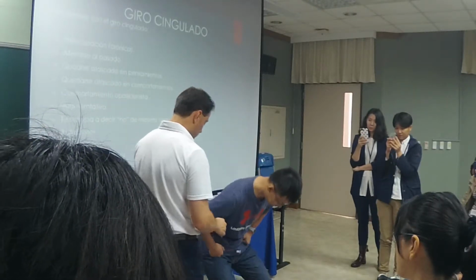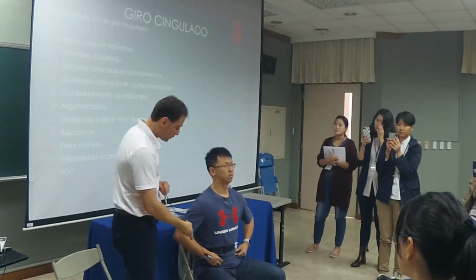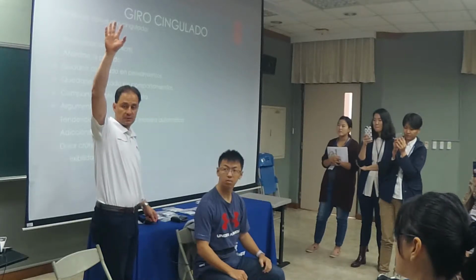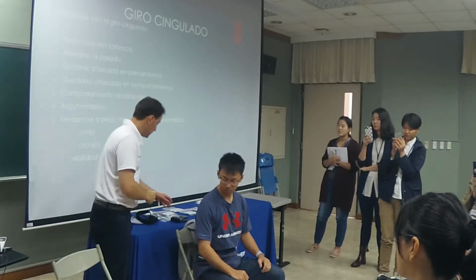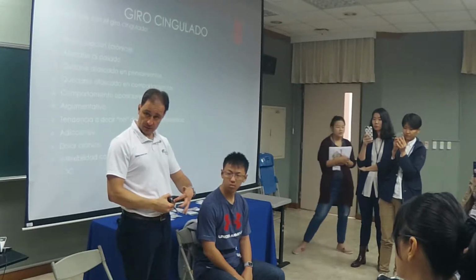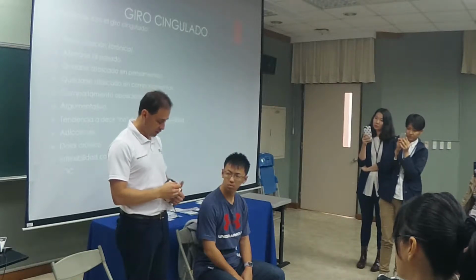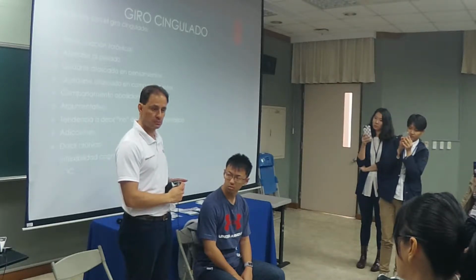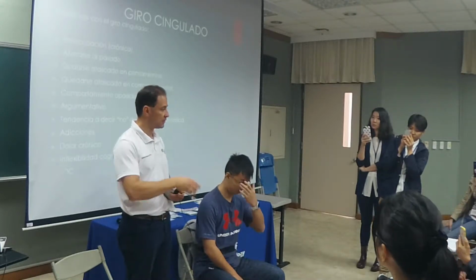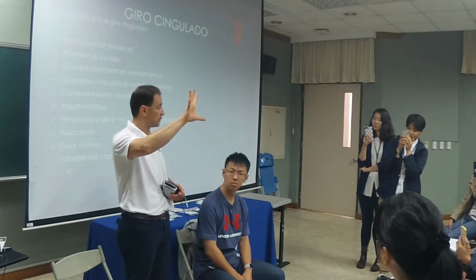Okay. So we have our setup ready for the breathing. Now why don't we just bring your arm up and bring the cable down, because sometimes they can lift their arms and pull on the cable. This has a specific order, which goes from left to right. The very first sensor we're going to place is the respiration, which goes into channel H. Now, BioTrace, I'll show you, has a way, if you don't remember, you have a command key on the keyboard you can type, and it will show you what goes where.